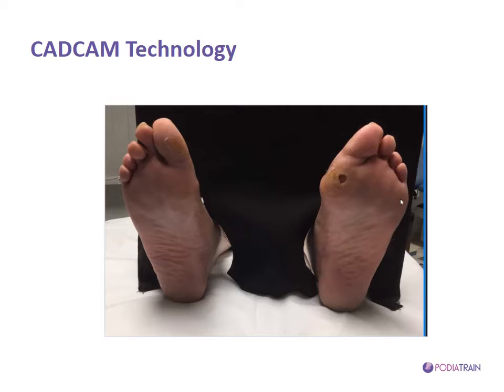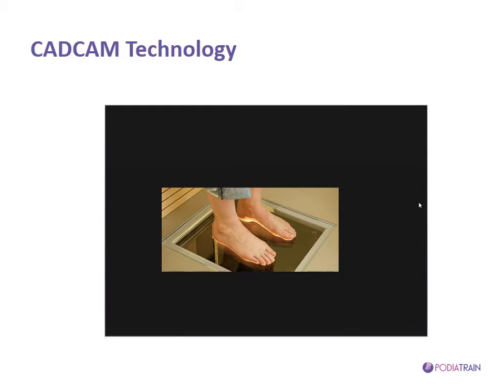However, before going into the actual design and manufacture of the insole, we should talk a little bit about CAD/CAM systems. CAD/CAM systems are systems which allow us to design and manufacture any object. It doesn't have to be insoles or orthoses; nowadays CAD/CAM systems are used to design anything.